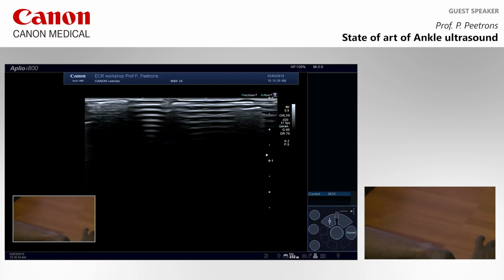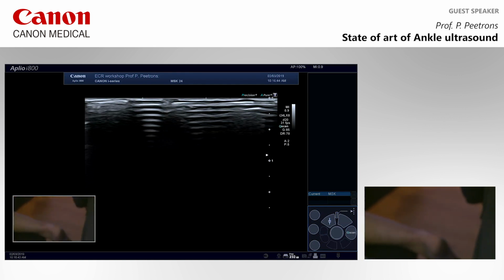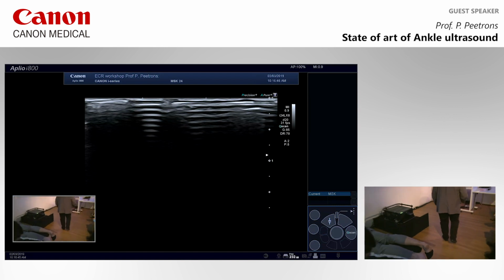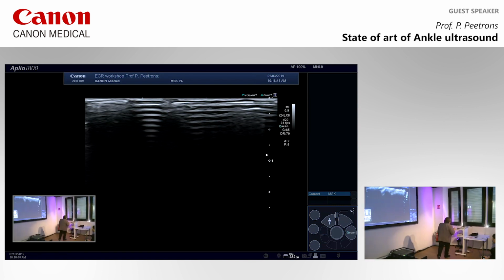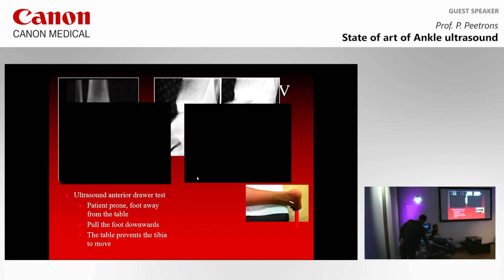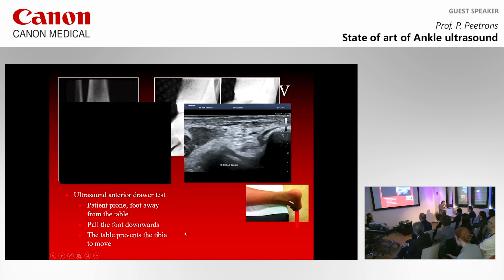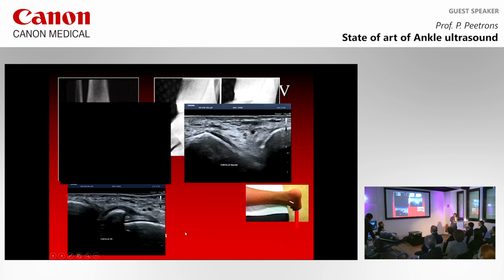This is what I do every time somebody is telling me that he has instability of the ankle. Every time, okay? So I can find if the instability is due to the ATFL lesion or not, okay? So this is the first example that I have to show you.